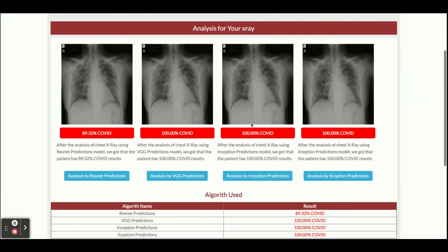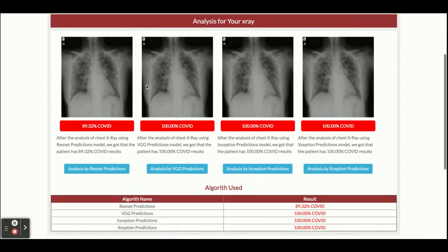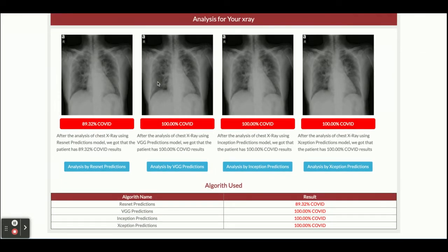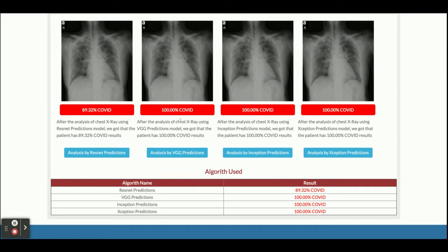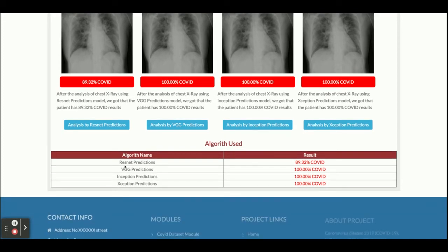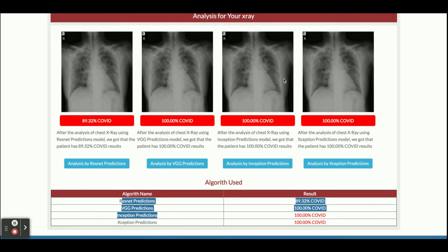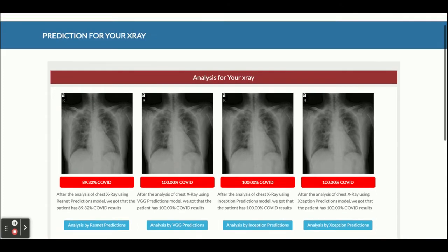After analyzing, here is the result page. We have used four models: the first is the ResNet prediction, the second is VGG, the third is Inception, and the fourth is Xception. This is the X-ray report uploaded by you, and all four of our models are saying that you are infected with COVID — meaning this X-ray patient is 100% COVID infected, as predicted by the models we trained on a large number of images.